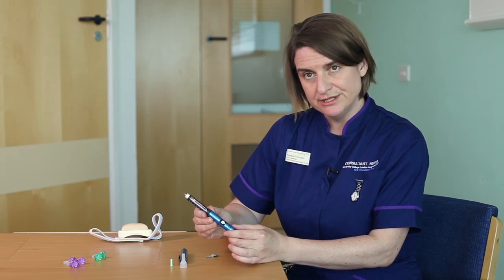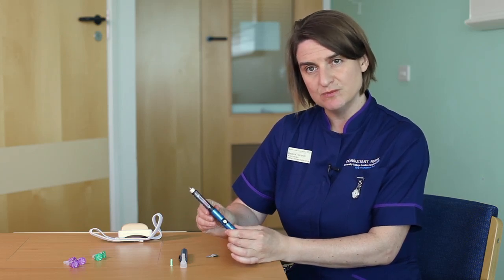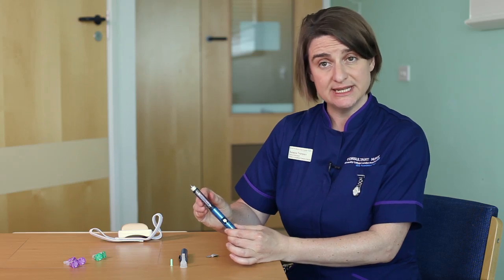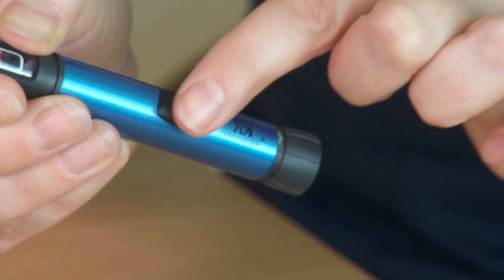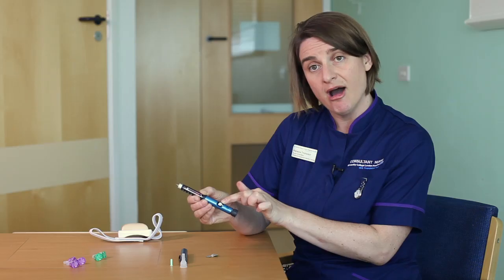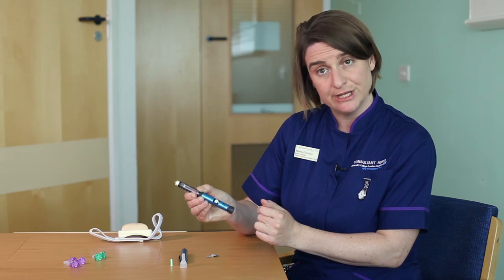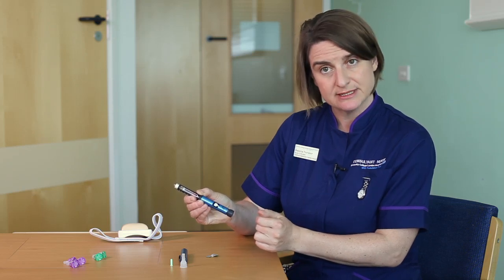Before you perform any injection you need to always perform what we call an air shot. You're pushing a small amount of insulin through the needle to get rid of the air. If you forgot to do this, your next injection dose would be much less than you thought you were giving. Looking at the pen you can see a dial with numbers on it. On this particular pen each line is equivalent to half a unit, and when I turn the dial you'll hear clicks. Each click is equivalent to half a unit.